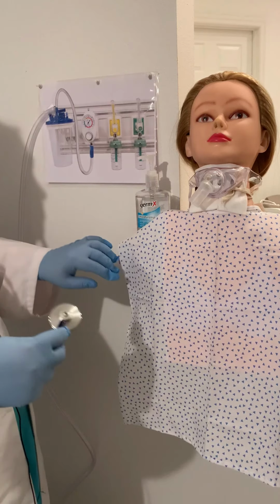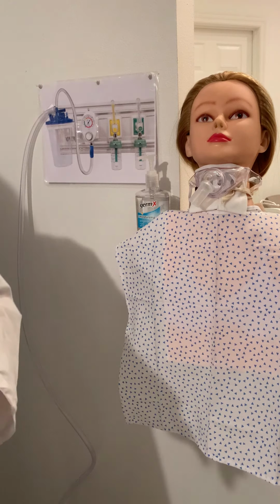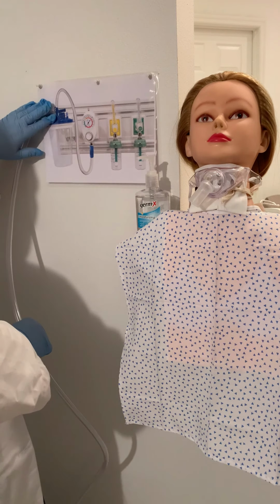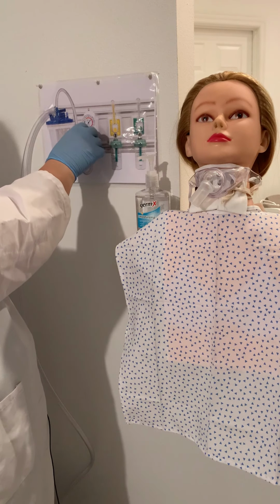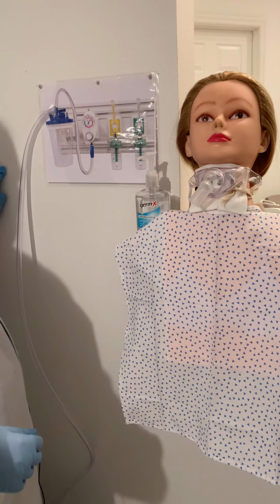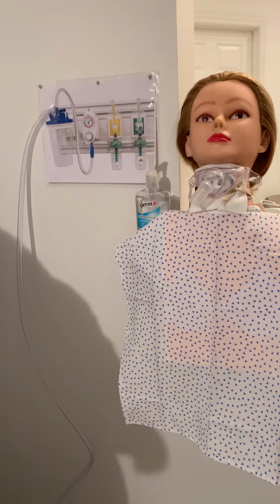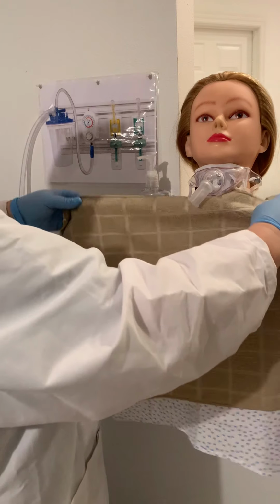Okay, Mrs. Harper, you sound like you need to be suctioned. So we're going to go ahead and check our equipment. We're going to make sure that our suction tubing is connected to the canister. We're going to make sure that our suction is turned onto continuous between 120 and 150. And then we're going to want to hyperoxygenate, so we're going to turn up her oxygen as well. And then we're going to place a towel across her chest.